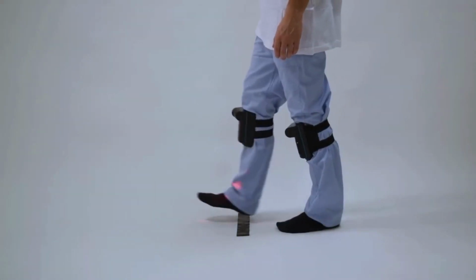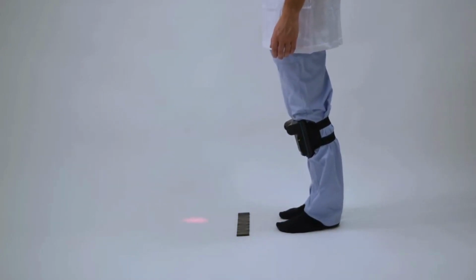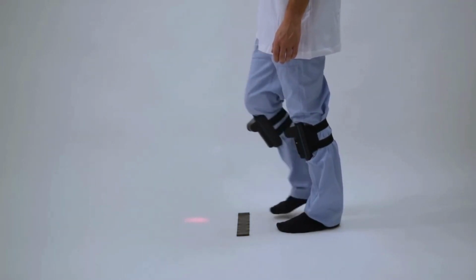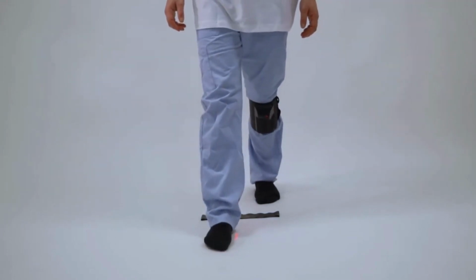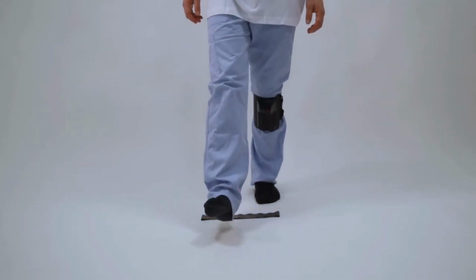Obstacle avoidance. It is the classic exercise of overcoming the obstacle and returning to position, with the addition of visual feedback. The patient will have to overcome the obstacle and achieve visual feedback, thus seeking a more precise movement. Then return to the starting position. It is suggested to perform a full set with the same leg and then change limbs.